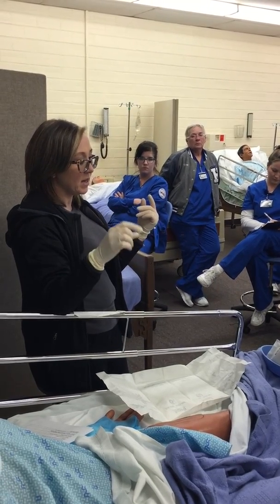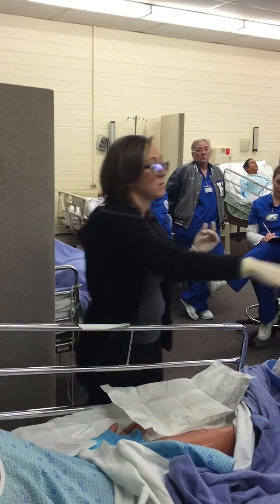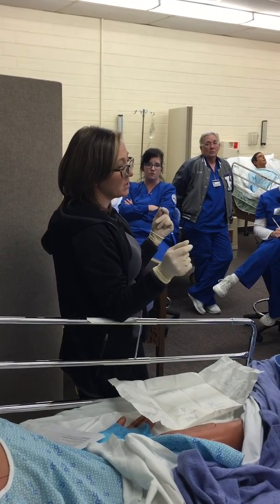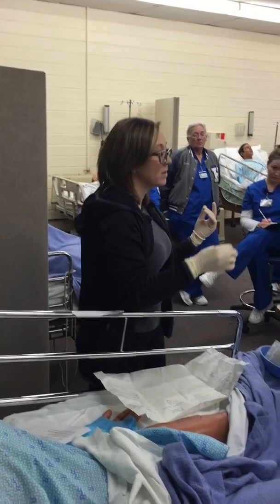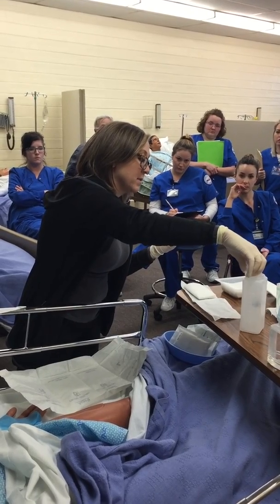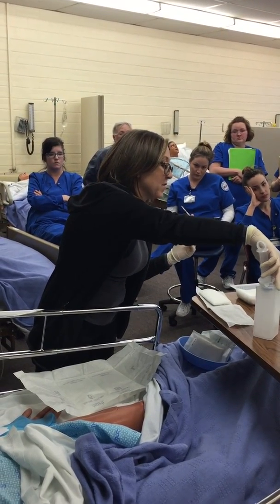So if I'm going to irrigate this, are these hands going to stay sterile? No. Is this sterile? No. The top's not sterile, the inside is sterile, yes? Okay, so this is going to be my non-dominant hand, or my dominant, however you want to do it. So this hand, I'm going to reach here and draw up whatever I want. I'm going to draw up probably a full syringe so I have enough. And it's okay for me to touch this as long as we're not sticking our fingers in here.